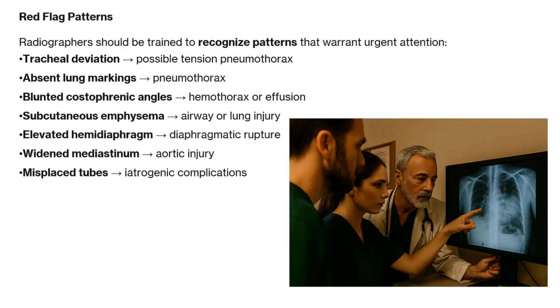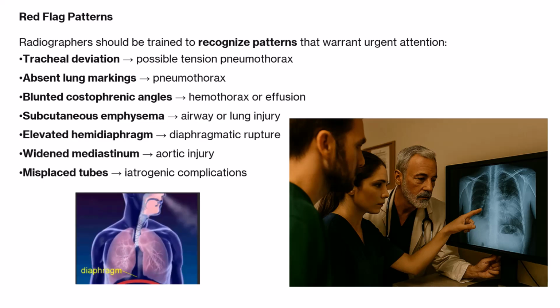Let's talk about imaging technique essentials. The view selection: AP portable chest X-ray is standard in trauma bays. Lateral or orthogonal views only if the patient is stable and localization is critical. Include the entire thorax. Don't crop out external objects. Example would be impaled items or tubes.